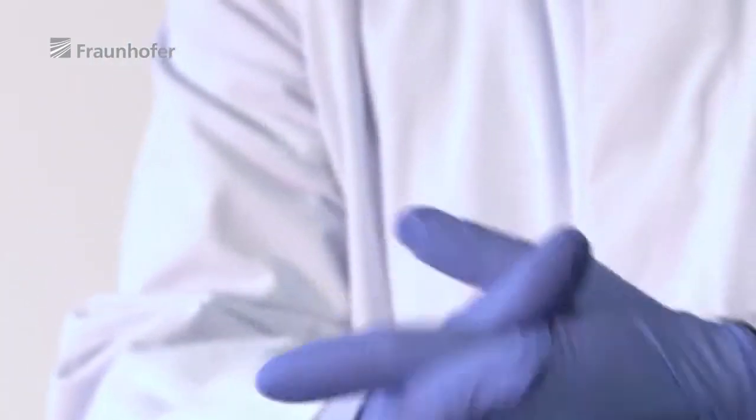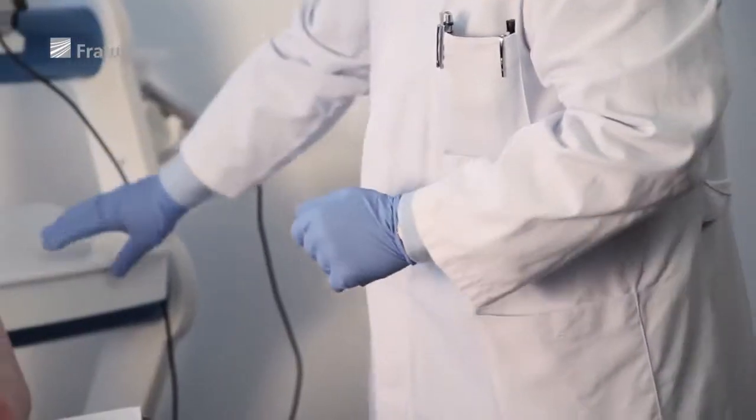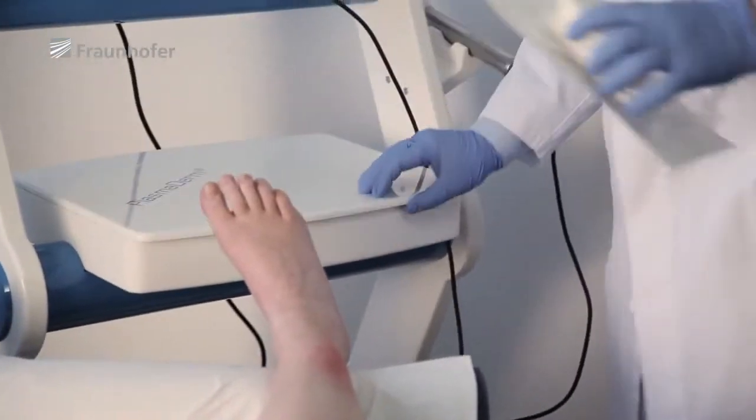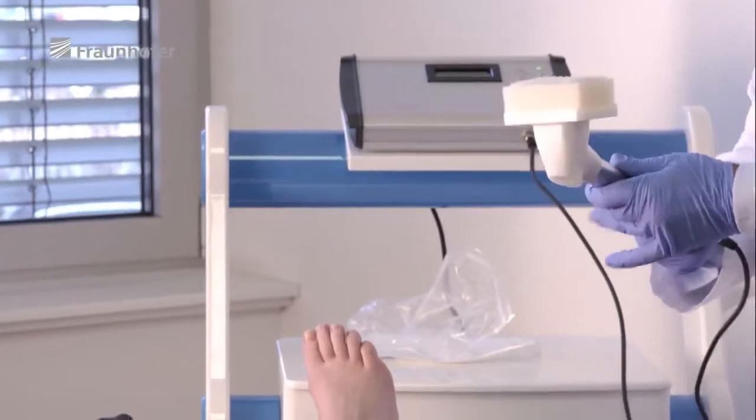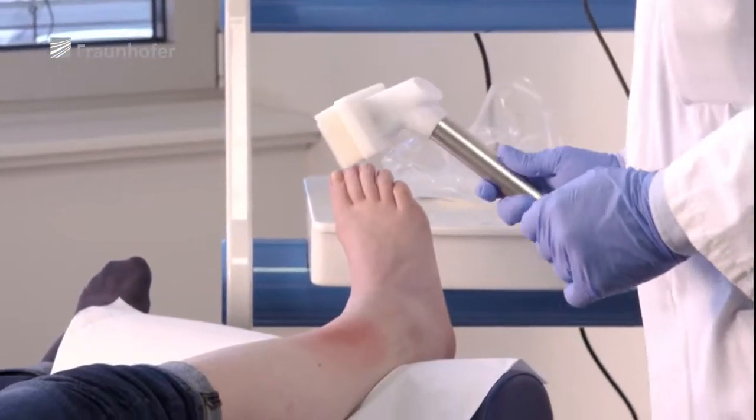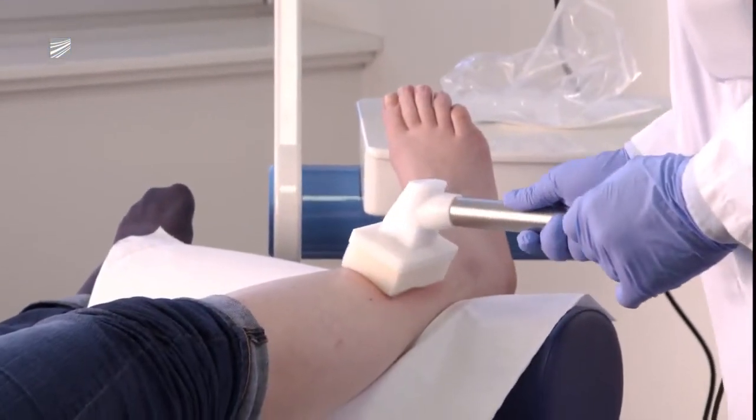Prof. Stefan Emmert from the Department of Dermatology at the University Medical Center Göttingen has completed a clinical study that demonstrates the positive effects of this treatment method. Around 100 PlasmaDerm devices are already in use.